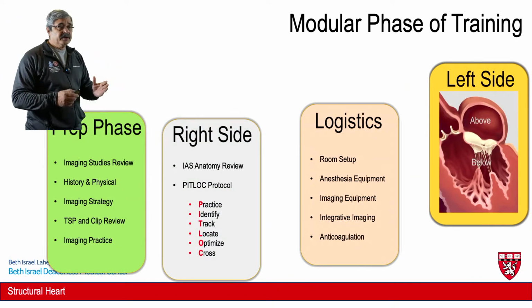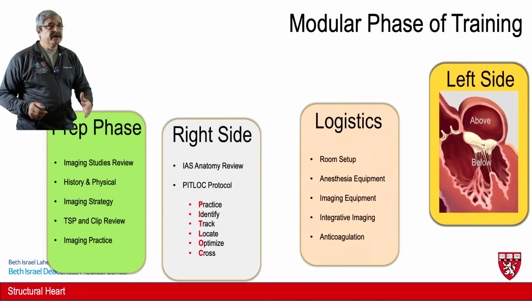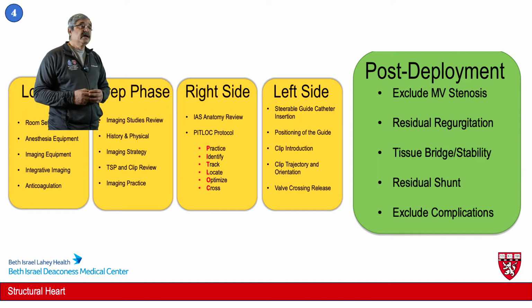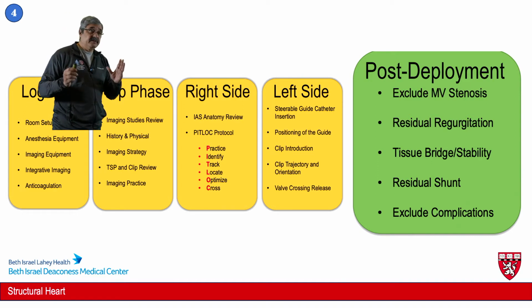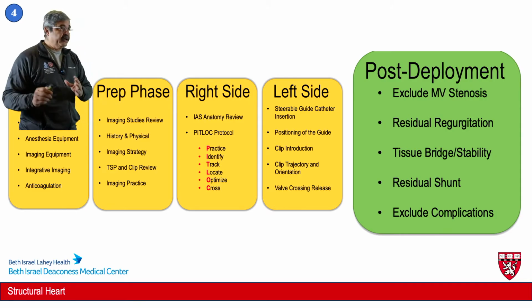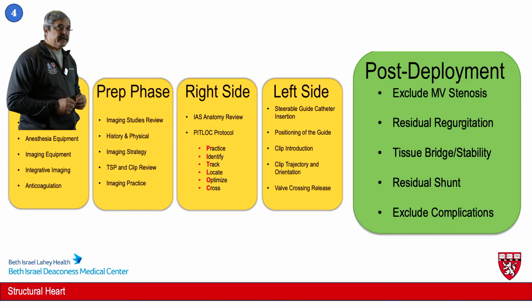So this is the modular phase, which gradually goes from the right to the left side, and we get to that. And after we've deployed everything comes the post-deployment assessment of whether or not this procedure is a success. So this is a complete science in its own right, and we'll briefly touch on that subject as well here.